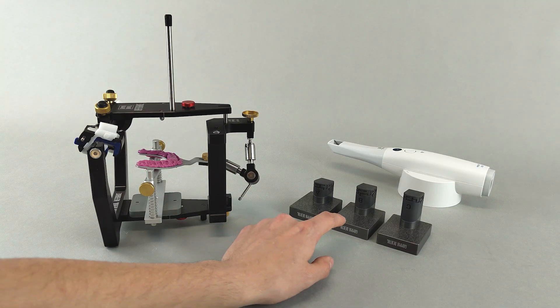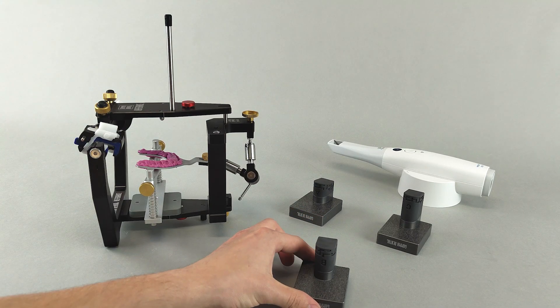A digital transfer block of the appropriate height is selected and mounted in place of the upper jaw model.